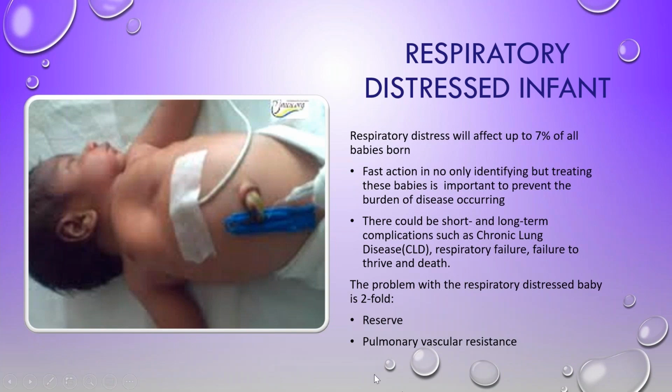And while we're here, one of the biggest problems with regard to resuscitation and looking after these babies in the beginning is maintaining the neutral thermal environment. Once again, if you look at this picture, we have a problem. This is not an acceptable method of maintaining this because there's no reflector here, and so the radiant heater will not give this baby the set temperature you have dialed in.